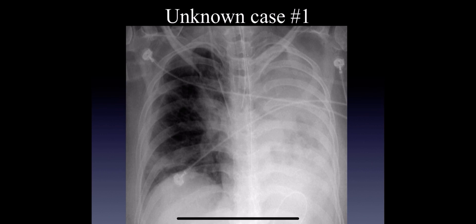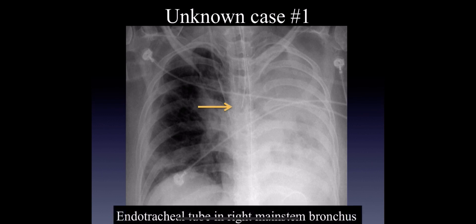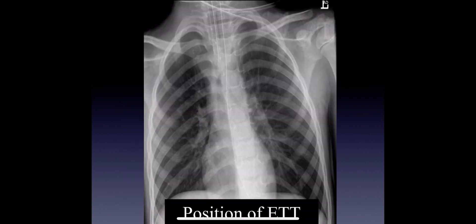Let's go down our checklist. Your eye is immediately drawn to the complete opacification of the left hemithorax, and you'll notice there is some degree of volume loss. We're suspecting this is a case of near-complete left lung atelectasis. Of course, we have a good differential for that, which includes malignancies and mucus plugging, which is really common in the ICU. But that should lead us to the fact that the endotracheal tube is in the right main stem bronchus, which is causing the complete left lung collapse. So the first thing to look at in ICU cases is generally the lines and tubes: what's their position, is the position appropriate, and what is the change from day to day?